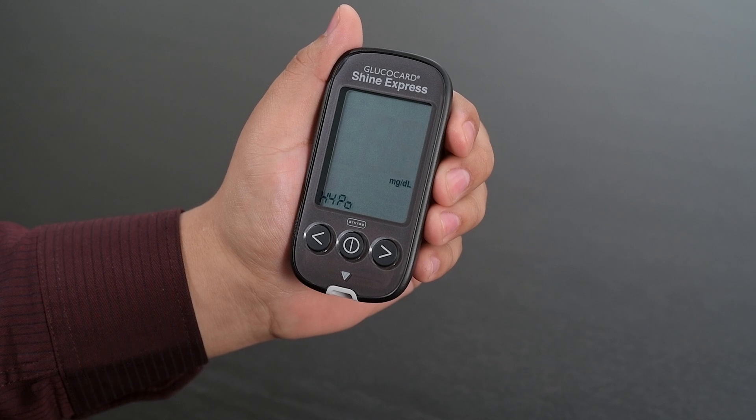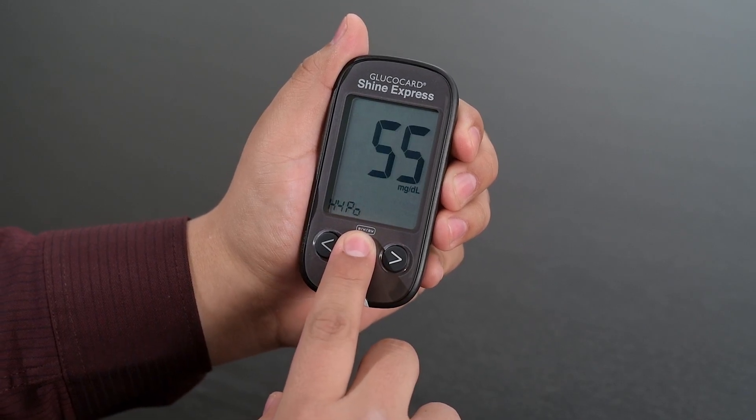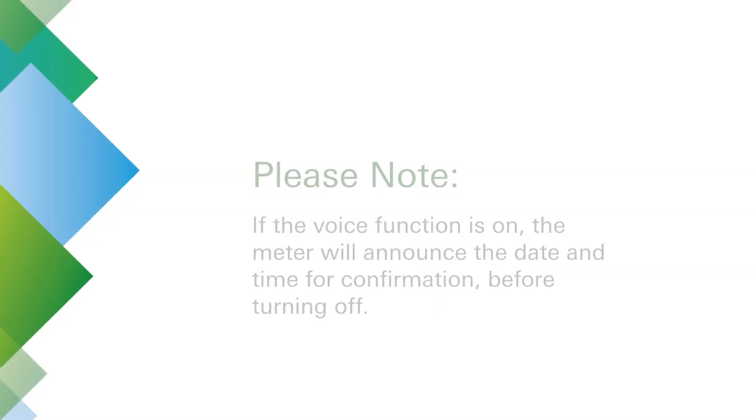Meter setup is now complete. Press and hold the center button for 3 seconds and the meter will save all of the settings and turn off. If the voice function is on, the meter will announce the date and time for confirmation before turning off.